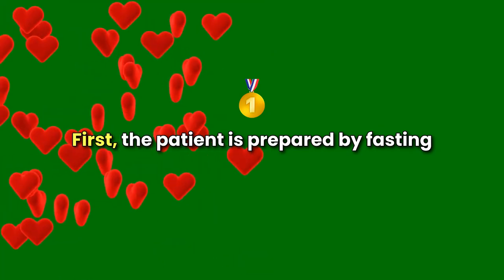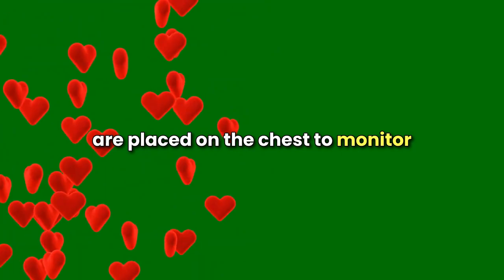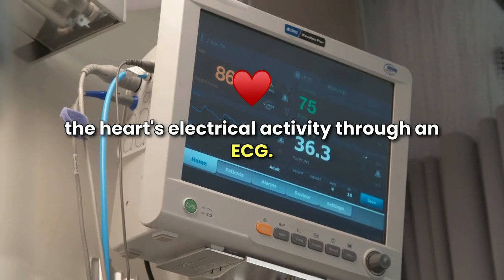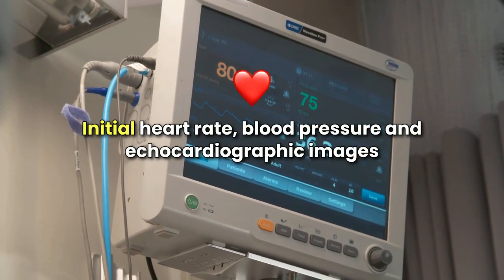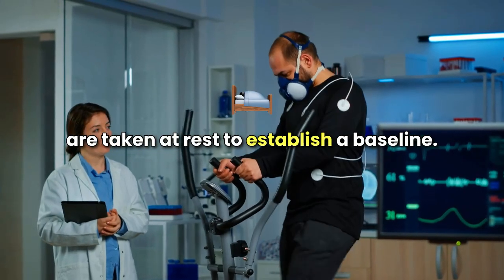First, the patient is prepared by fasting for a few hours beforehand, and electrodes are placed on the chest to monitor the heart's electrical activity through an ECG. An intravenous, IV, line is inserted to administer the dobutamine. Initial heart rate, blood pressure, and echocardiographic images are taken at rest to establish a baseline.